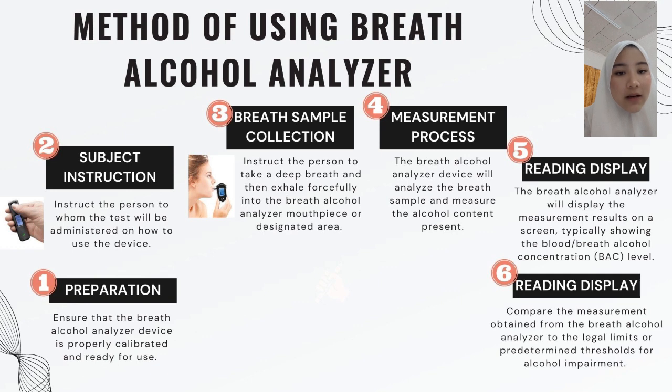Second, subject instruction. Instruct the person to whom the test will be administered on how to use the device. Provide clear and concise instructions on how to blow into the device correctly. For this step, you must press down the button until the warm-up sign shows for 10 seconds.